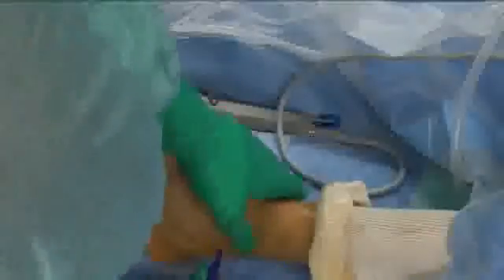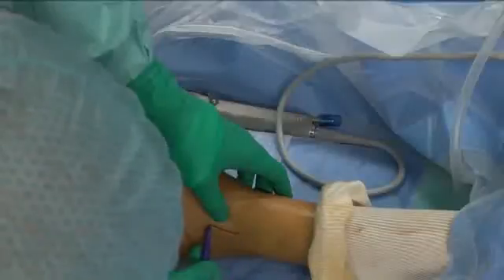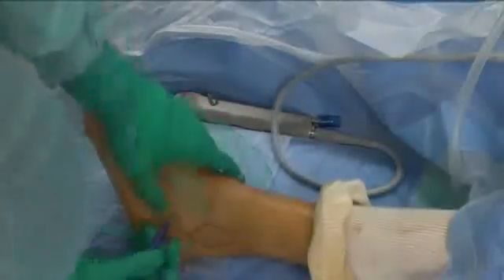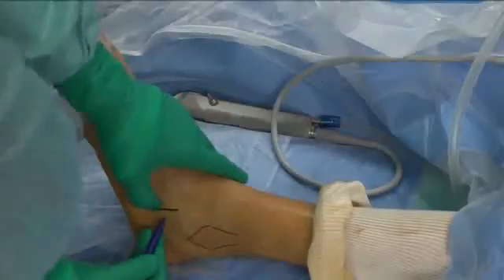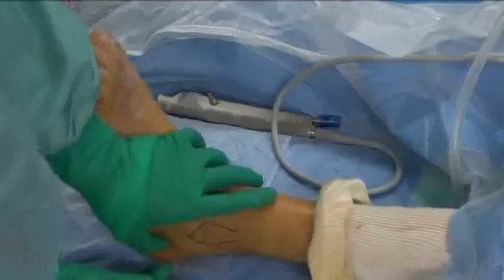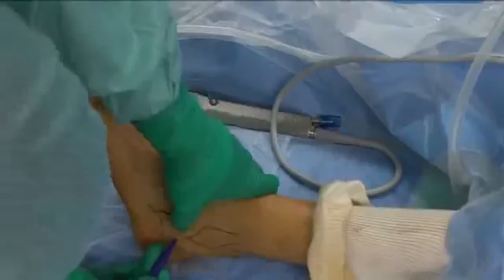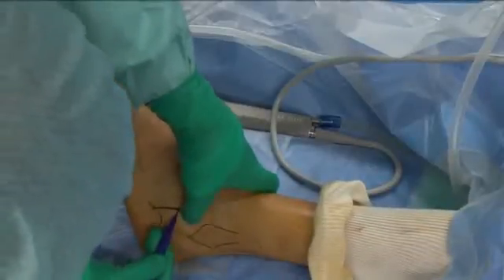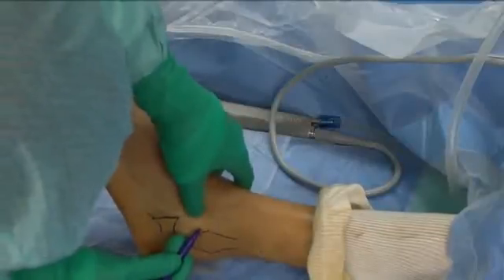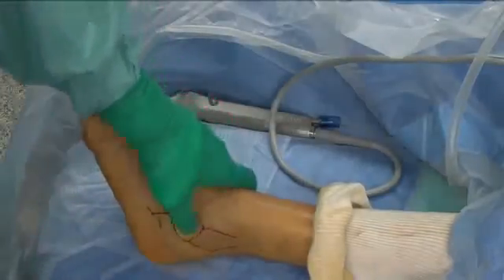The lateral malleola is outlined first. The calcaneal cuboid joint is then drawn. The superior part of the anterior process of the calcaneus corresponds to the floor of the sinus tarsi, in the center of which a soft point may be palpated which helps in outlining the anterior and superior part of its circumference.